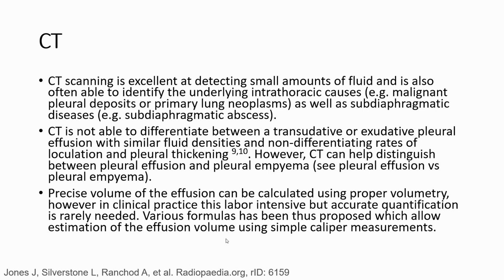CT scan is excellent at detecting small amounts of fluid, and is also often able to identify the underlying intrathoracic cause, for example malignant pleural deposits or primary lung neoplasm, as well as subdiaphragmatic disease. CT is not able to identify differences between a transudative or exudative pleural effusion with similar density, and is non-discriminating for loculation and pleural thickening. However, CT can help distinguish between pleural effusion and pleural empyema.